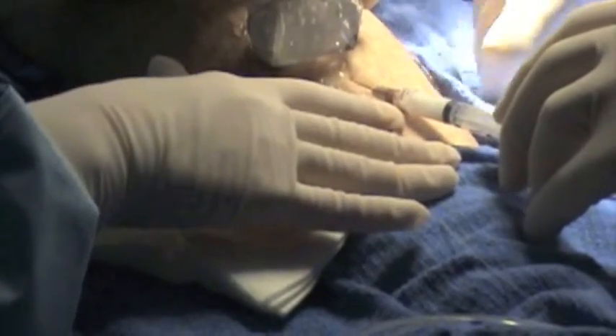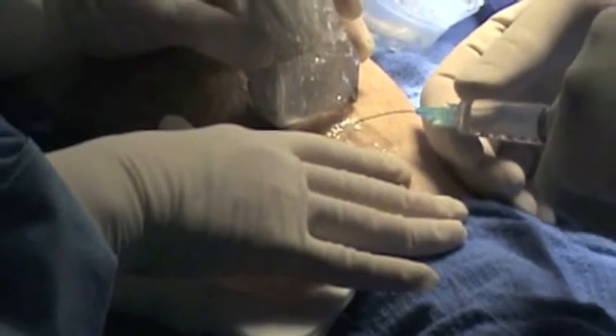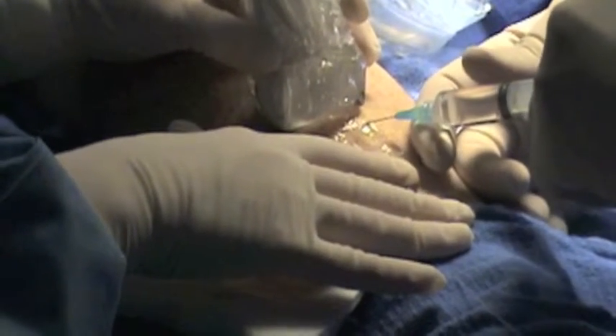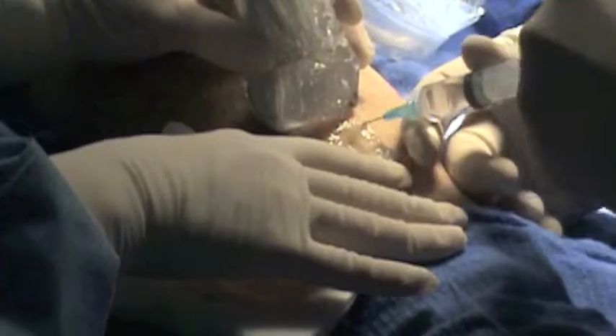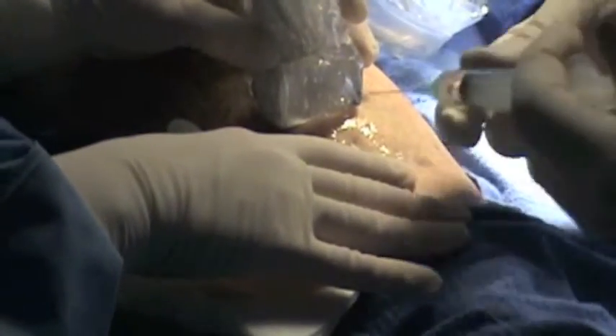After injecting the foam, I'm going to put tumescent around the area where the perforator is so we can do the laser. We'll show you that on the ultrasound in just a minute.